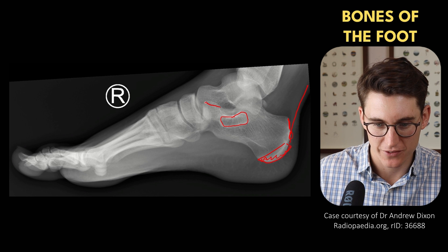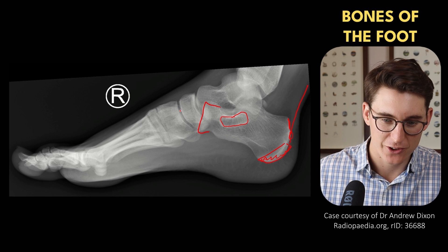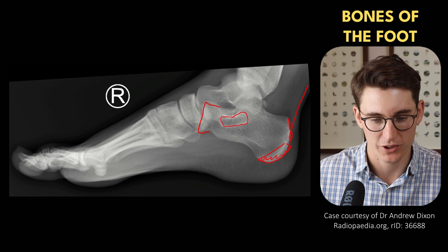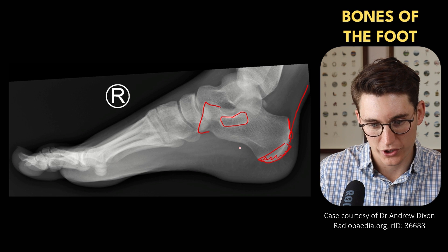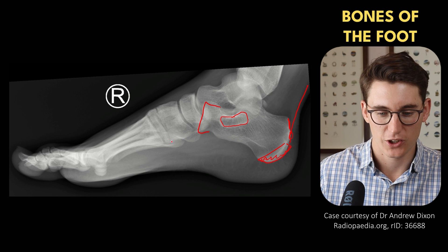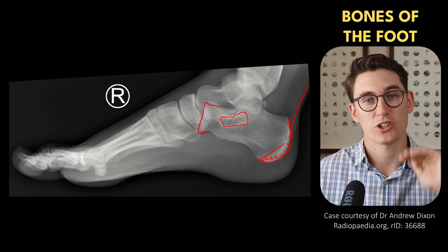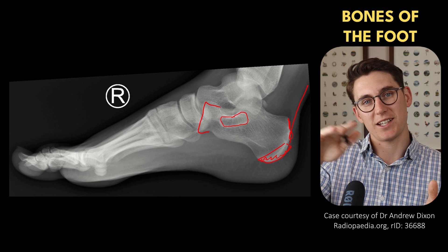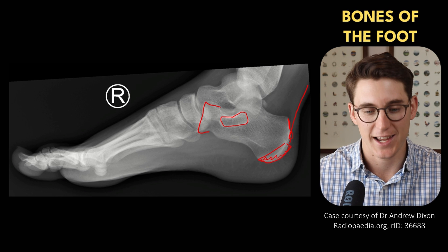We've got an anterior process of the calcaneus that articulates with our cuboid bone. Anterior to the navicular bone and medial to the cuboid bone are our three cuneiform bones, which are quite difficult to appreciate here. We can see our metatarsals and our sesamoid bones, and we can draw an arch that runs along the longitudinal aspect of the foot known as our longitudinal arch — both a medial and lateral longitudinal arch. You can also see a transverse arch drawn across the Lisfranc joint through the medial, intermediate, and lateral cuneiforms as well as the cuboid bone, providing stability laterally to the foot.